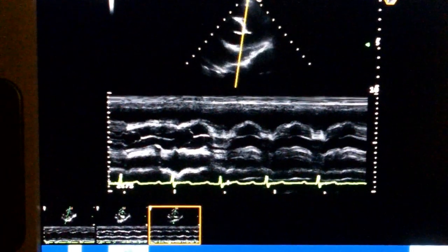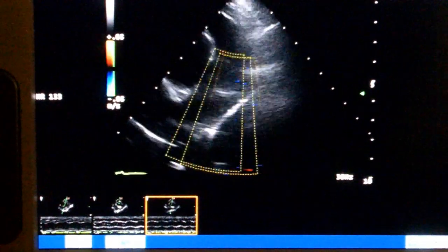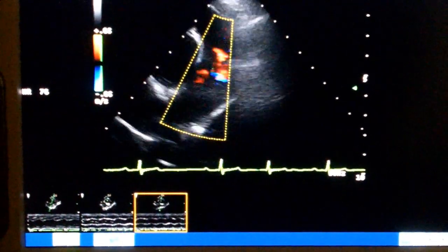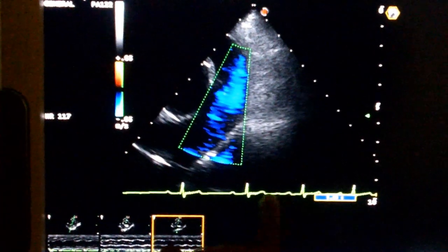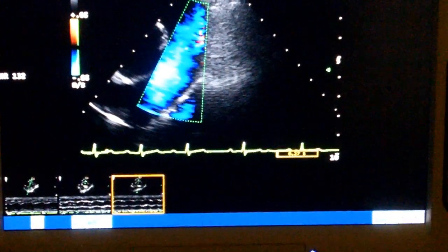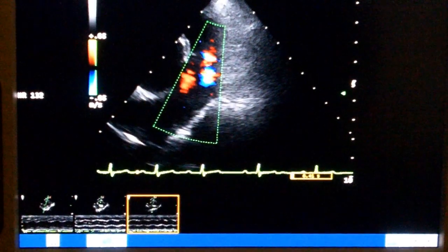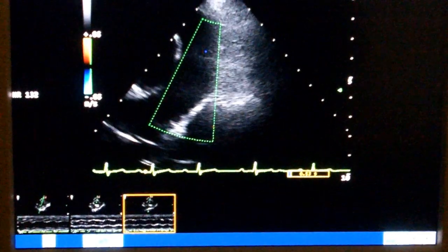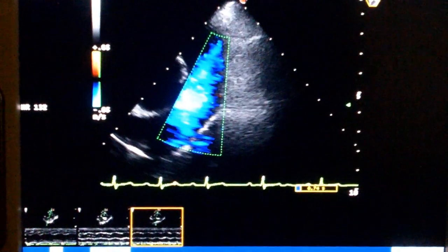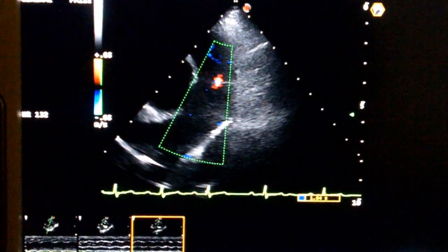Now we can go up and look at the pulmonary outflow tract — the right ventricular outflow tract. We can put some color on that, and we can see he does have a little bit of pulmonary insufficiency there. We can see the synchronization to the EKG. Right after the contraction, we're going to see a uniform exit of blood leaving the right ventricle, then valve closure. And then we can still see a retrograde movement of blood through the defect in that pulmonic valve — just a little bit of pulmonary insufficiency there, a little flame coming up.